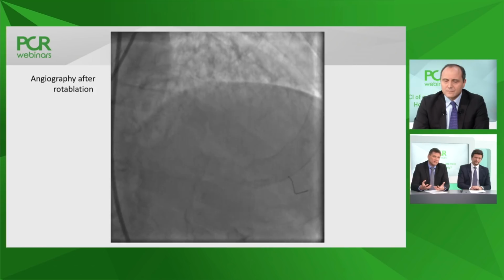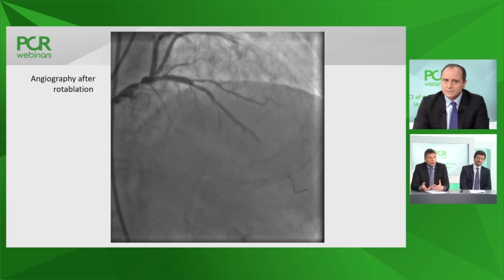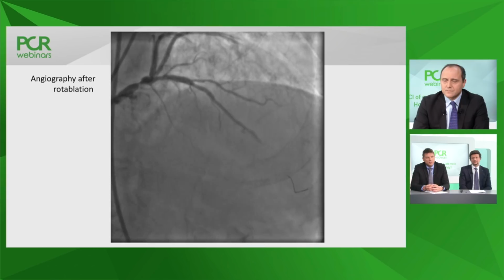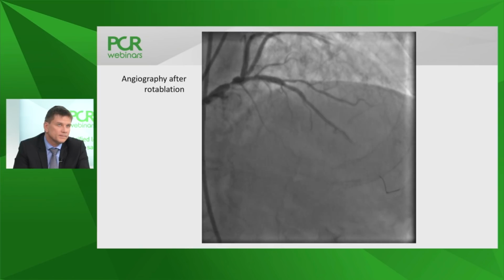And you need to think what you want to do now. Either you now start the intervention on the distal left main, or what you could decide, and this is where the IVUS gave us some insight, I think you could decide even to do some rotablation on the circumflex, because the circumflex ostium was really, really tight. What did you do, Flavio, actually next?